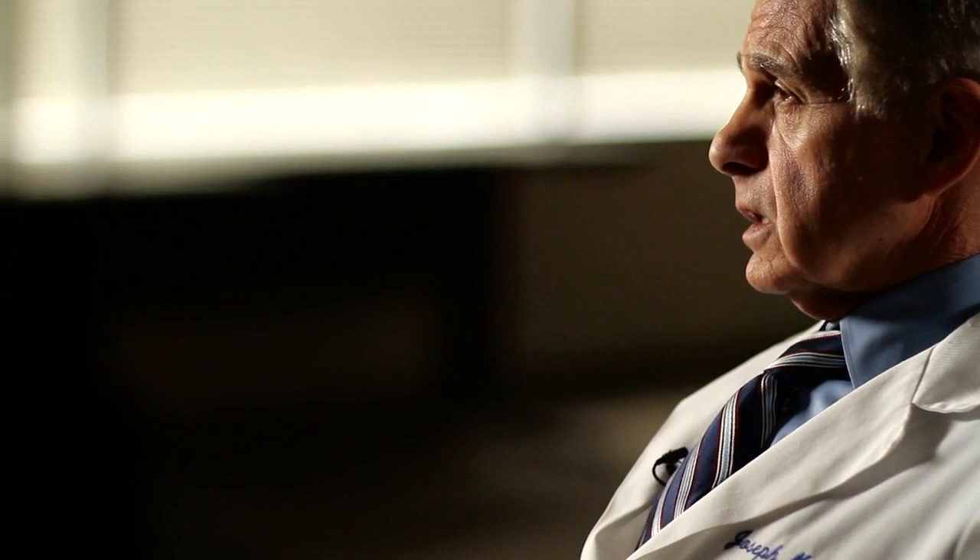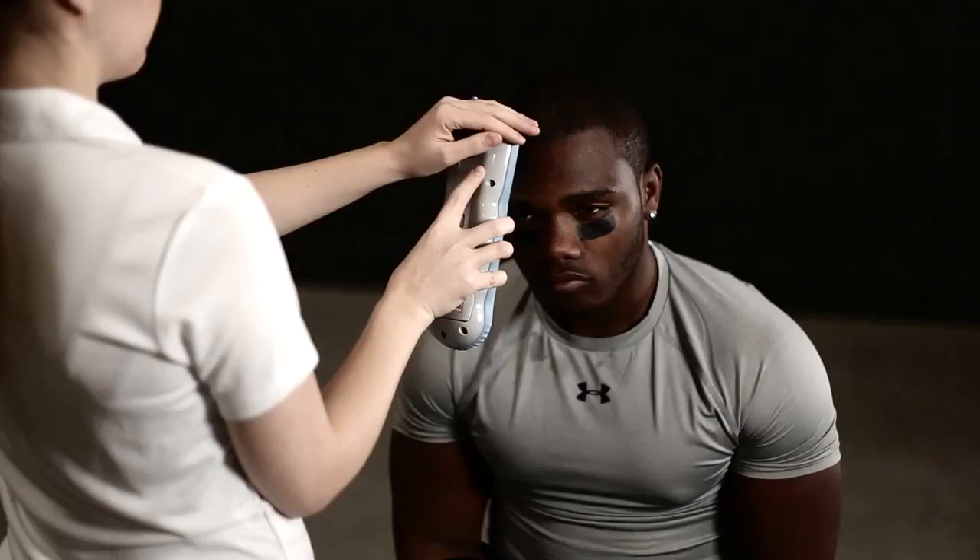I've been able to use this in sports medicine, in professional football players as well as college football players, evaluating them for concussions. We use the Infrascanner concurrently to satisfy ourselves that a CAT scan would not be indicated at that time, and that clinical evaluation and further judgment would be more appropriate. We've been able to use this as a triage instrument to more effectively utilize CAT scanning in athletes with concussions.